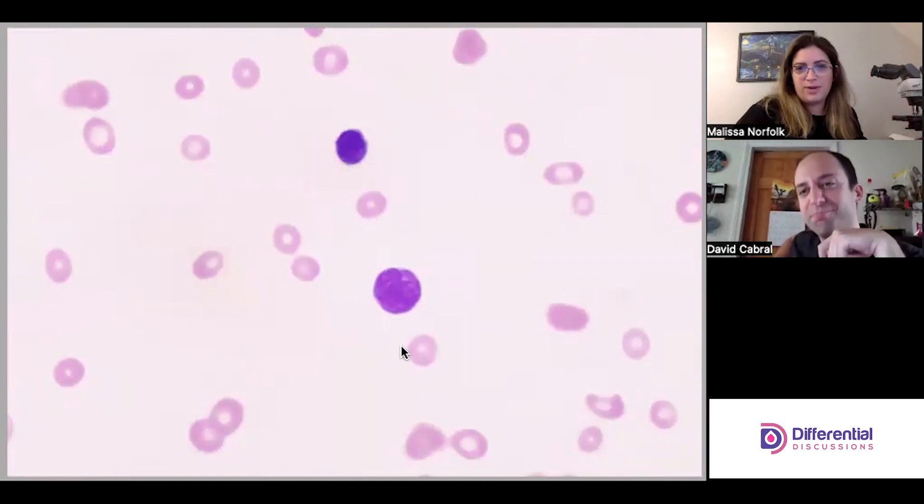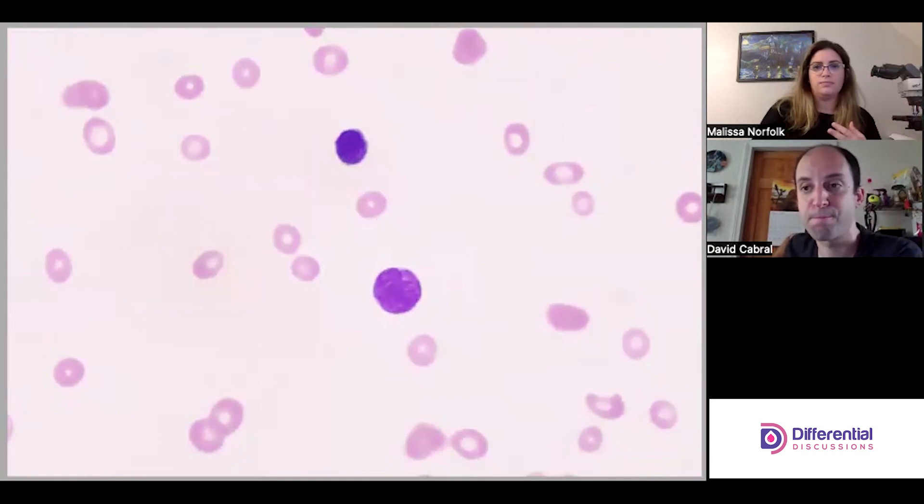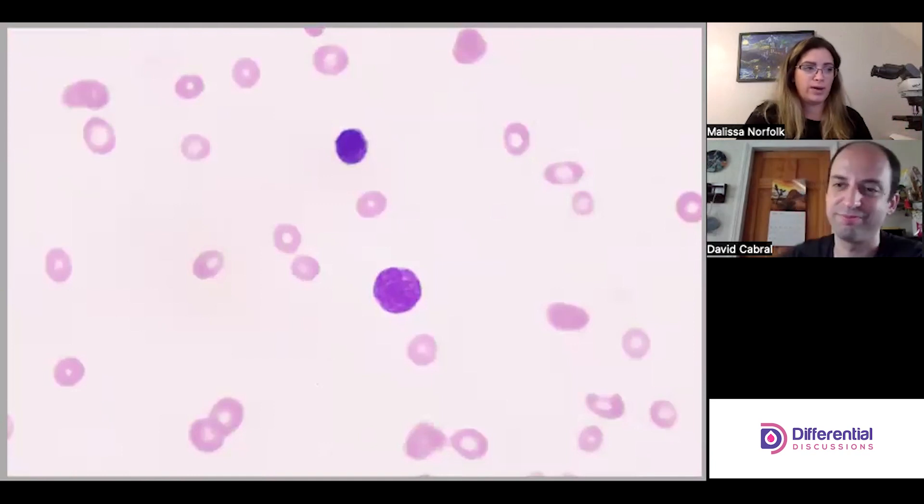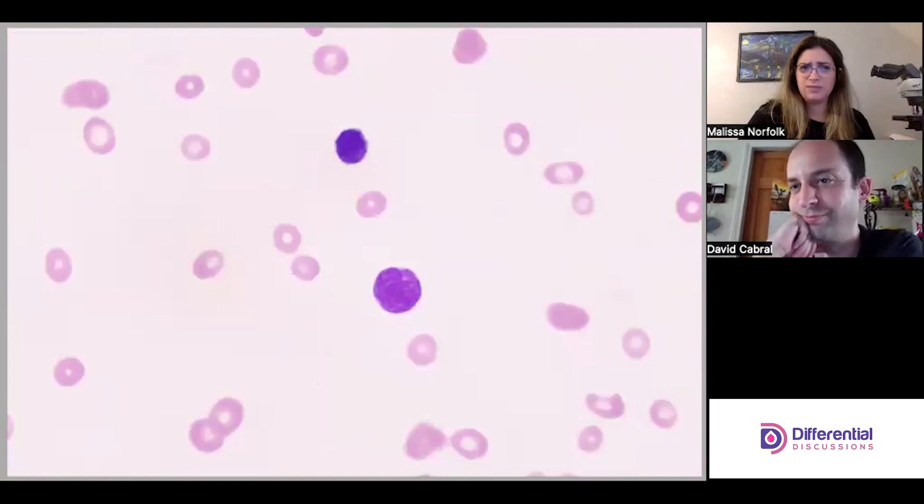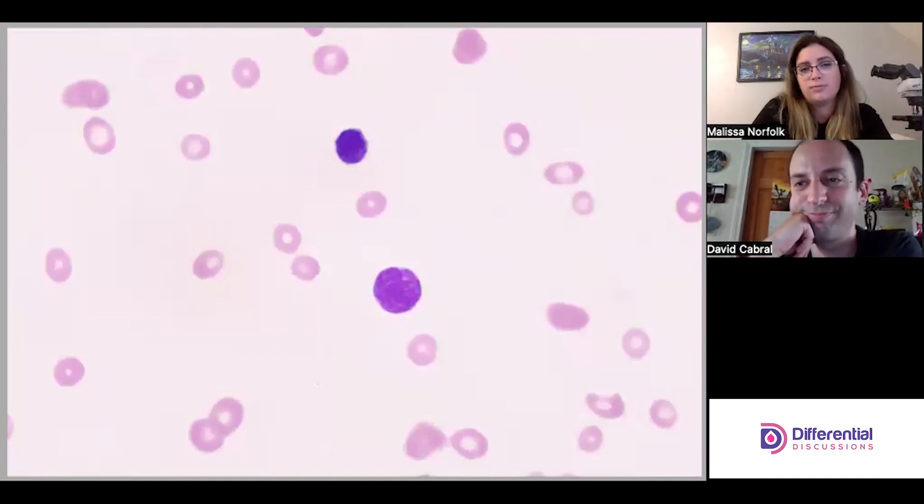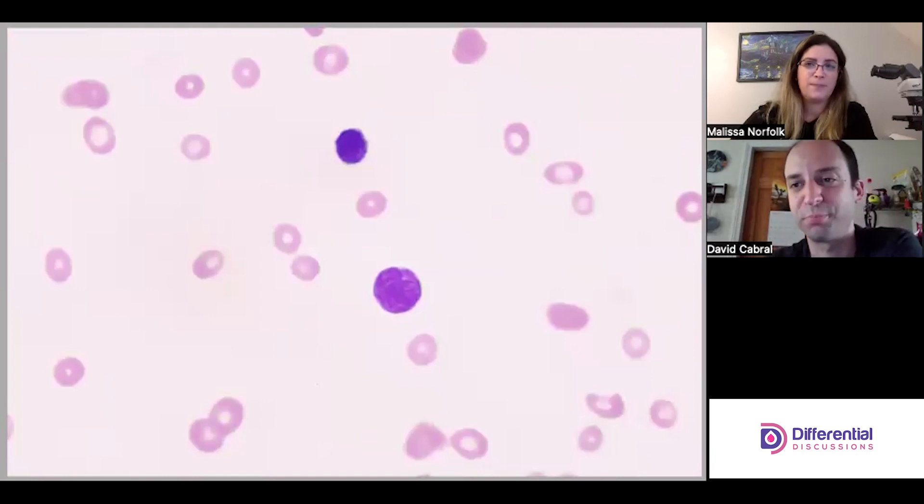I think summary, one of the big things people should take away are the anemia and thrombocytopenia. The severity here, we can safely say it's acute. Also with the number of white cells that we're seeing, because if it were chronic there would be much more white cells present. And then ALL blasts, sometimes they look interesting with scanty cytoplasm and it almost looks like they're lobulated. They don't look quite as clean as myeloid type blasts where it almost looks like you're cookie cuttering and then hole punching in the center. Here it's a little bit harder. It's really difficult. These are tough to teach and tough to learn. Anything with lymphs is tough.